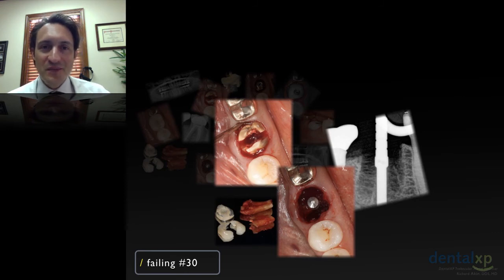The other thing that's tricky about immediate molars that I found, though, is curve of Spee and curve of Wilson. And when we talk about that, sometimes we're tempted to place implants upright, but we need to realize that implants need to follow those two principles from occlusal principles, as far as how the implant should be angulated. We want the occlusal forces along the long axis of the implant, and we remember those things when we're doing immediates.